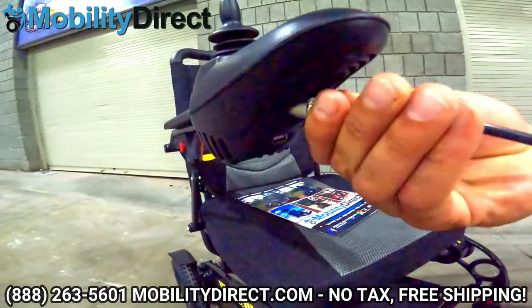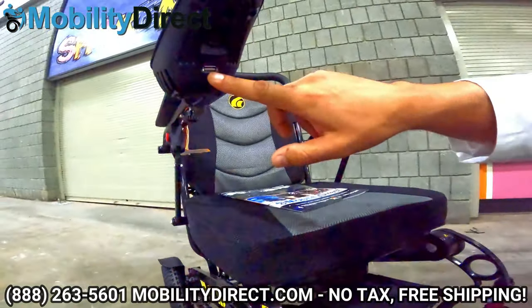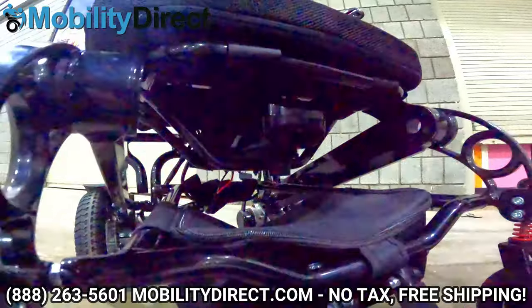I'll show you what it's like to plug it in — that's it. You'll also notice there's a USB charging port, so if you have a USB-powered device like a cell phone or tablet, you can charge your smartphone or tablet while on the go.